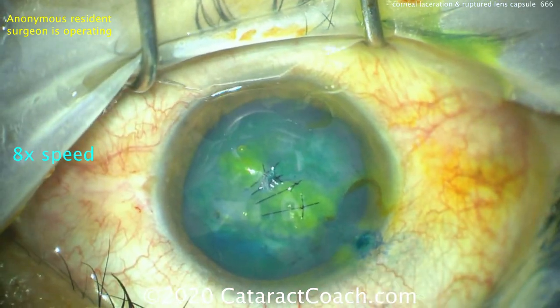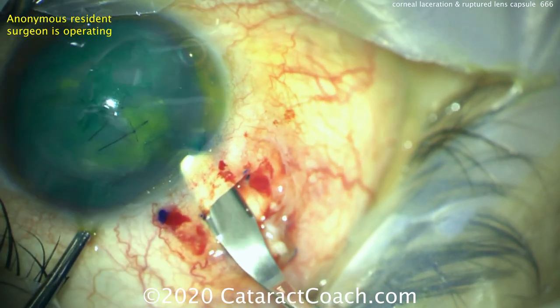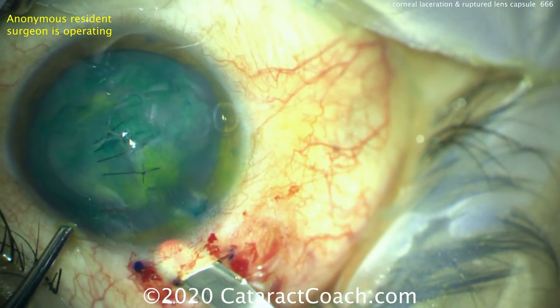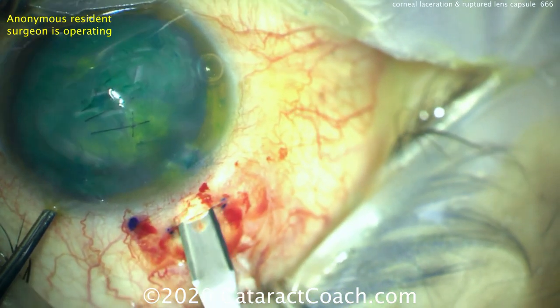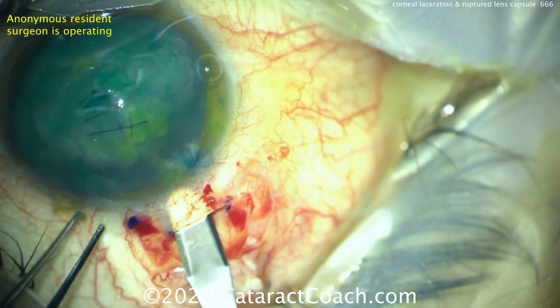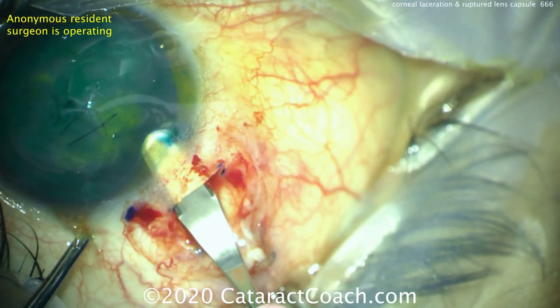The cornea is now sealed up. Time to make a scleral tunnel to remove the lens material. On a young person, we can remove the lens material just with two paracentesis incisions, doing a bimanual IA — the lens is soft and just aspirated. But on an older person, there may be a nuclear component and you may need to use the phaco probe. Don't make a corneal incision — leave the poor cornea alone, it's had enough trauma. Make a scleral tunnel.